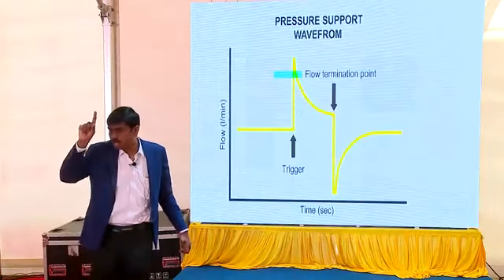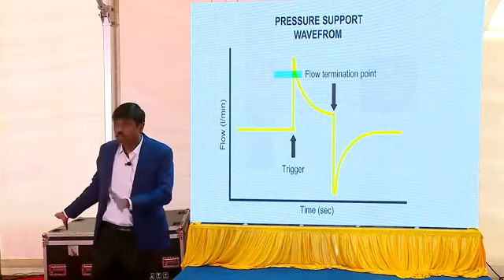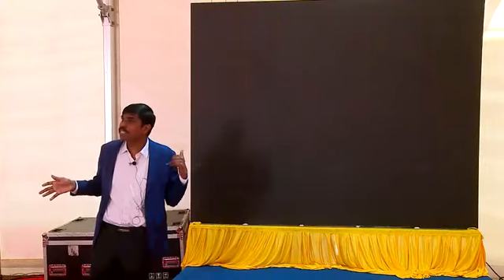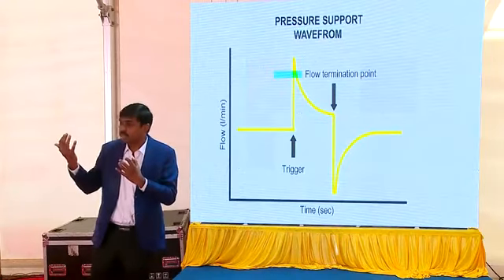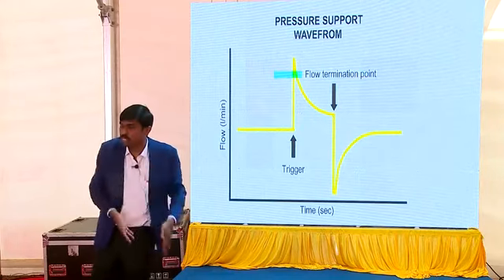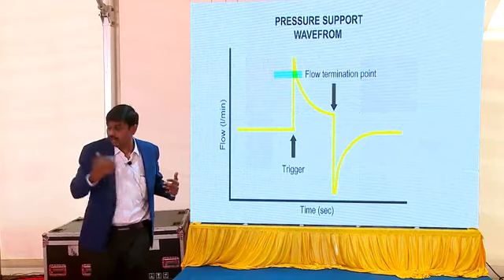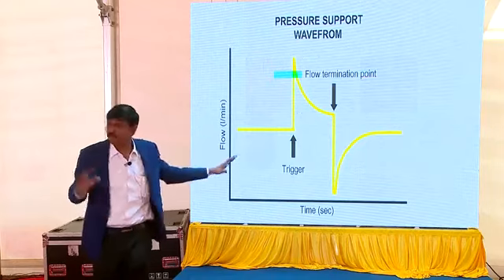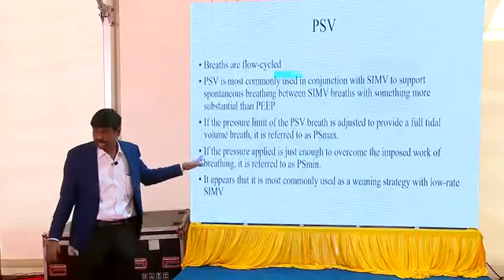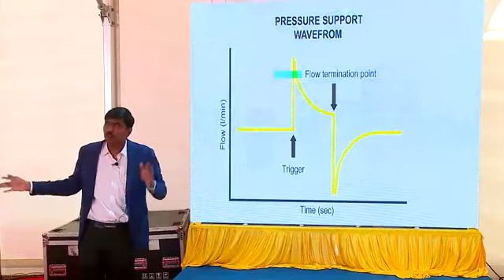So in usual ventilation, once 0.3 seconds is over, you move to expiration. So there's no control by the baby. Whereas in PSV, the machine recognizes the flow, the change in direction. It's always positive, inspiratory. Suddenly the baby takes a breath, there is an expiration. The change in direction is detected and it immediately changes over. That's called flow cycling. So PSV is more for weaning, because now you let the baby itself control both inspiration and expiration.